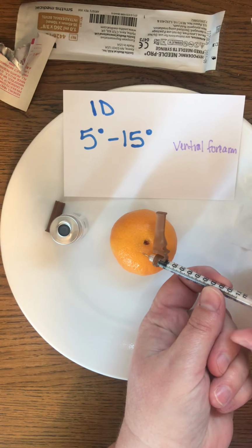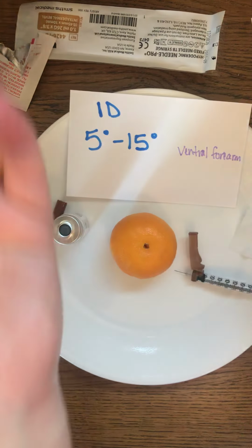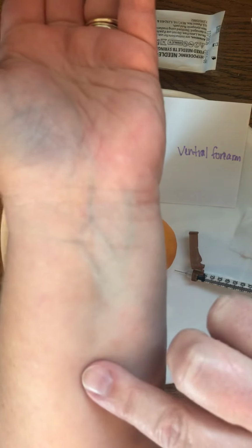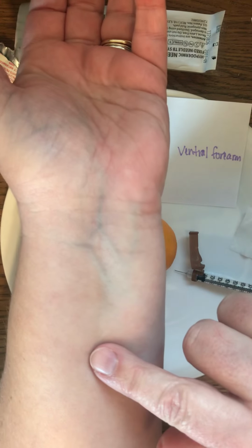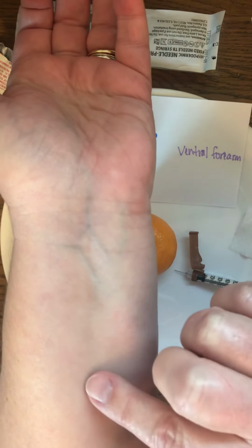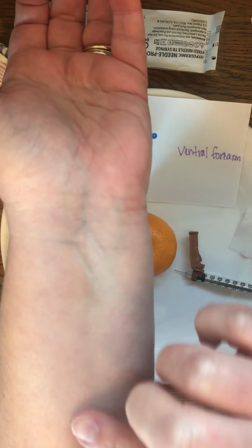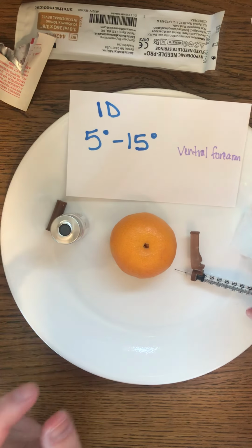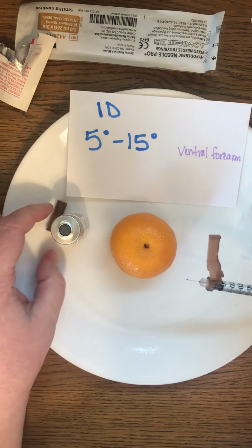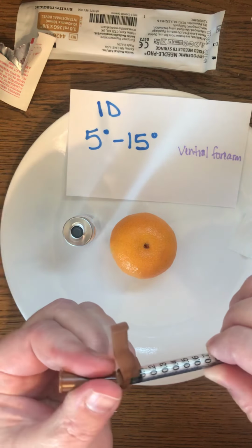If this was in the right place on the person and their actual skin, you would see a little bleb form. It's called a bleb or a wheal, and it's essentially a little bubble of where the fluid is underneath the skin, because it's right underneath so you could see it. Obviously you can't see that on the orange, but that is what you are looking for in an intradermal injection.